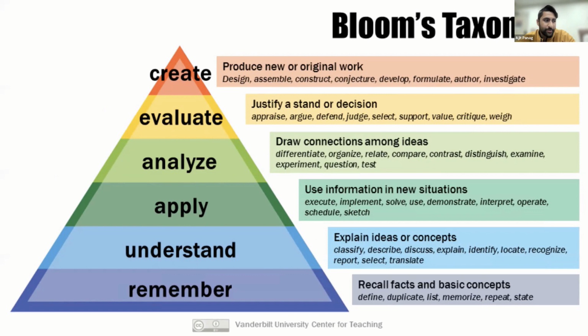And so utilizing simulation in point-of-care ultrasound and vice versa, using point-of-care ultrasound in simulation, helps us remember the indications on when to do ultrasound, and understand and practice image generation and interpretation. So kind of working our way up the pyramid, and then hopefully apply it to clinical care. So as you can see, it helps us recall the facts and basic concepts, maybe explain those ideas, apply those to clinical situations. And then as you get higher and higher into the pyramid, maybe even drawing connections among ideas.